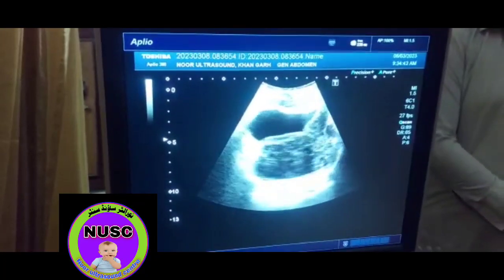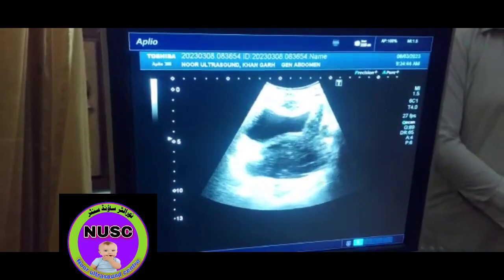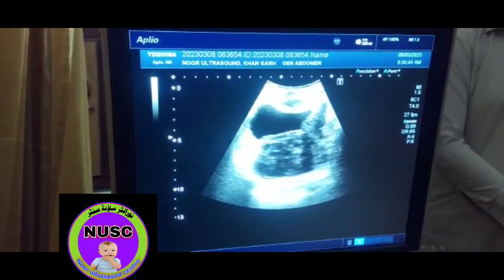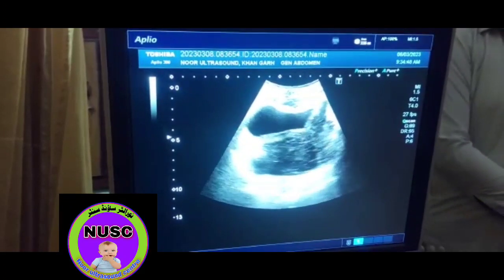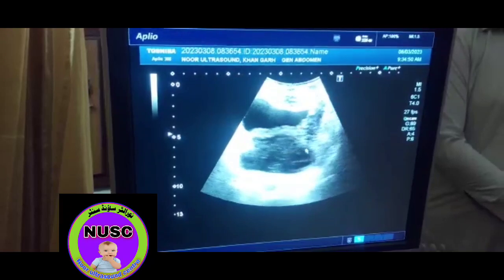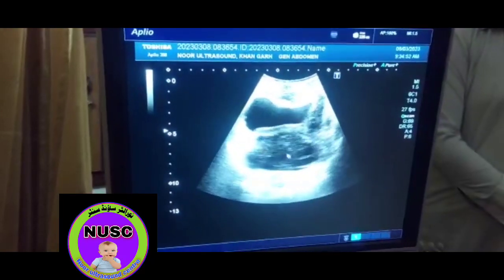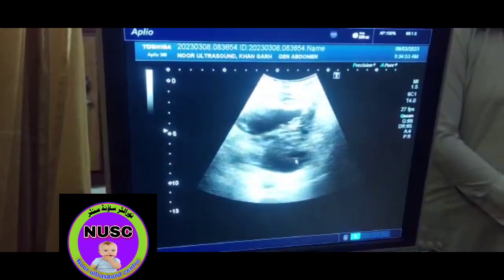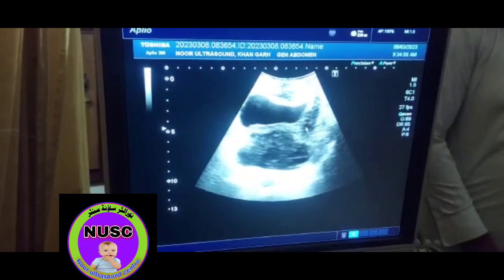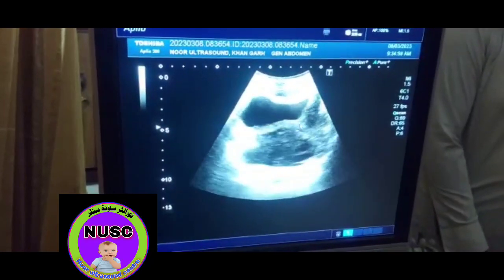Here you see, this is the urinary bladder. It is slightly thick-walled. And this is the prostate, which is very heterogeneous and abnormal-looking, with a little bit of extension along these muscles.